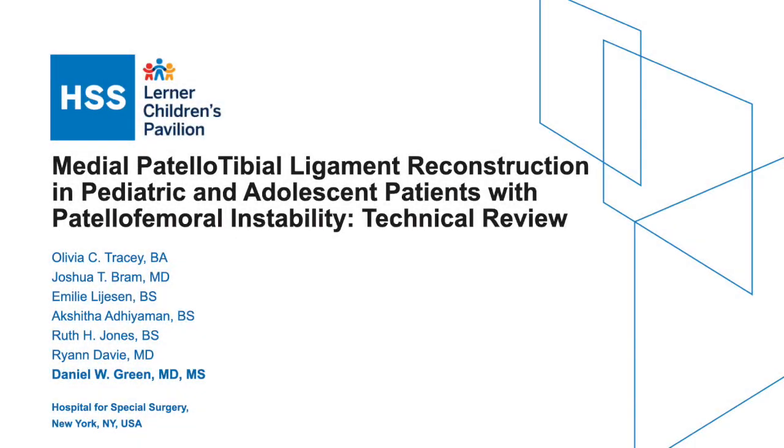Here we present a technique for medial patellotibial ligament reconstruction in pediatric and adolescent patients with patellofemoral instability.